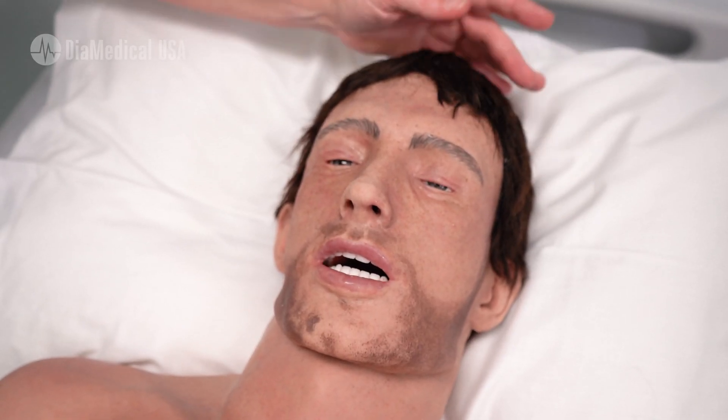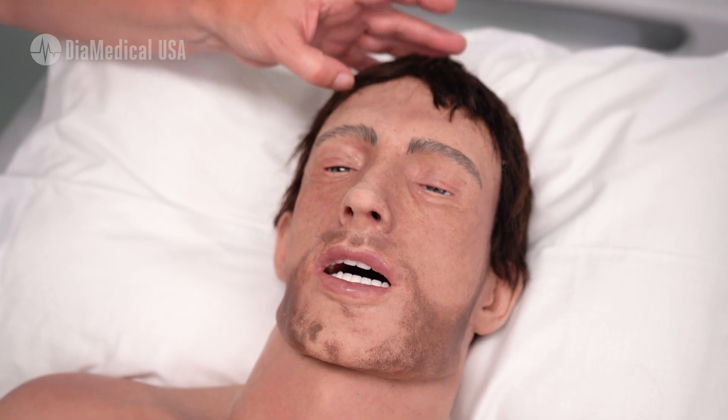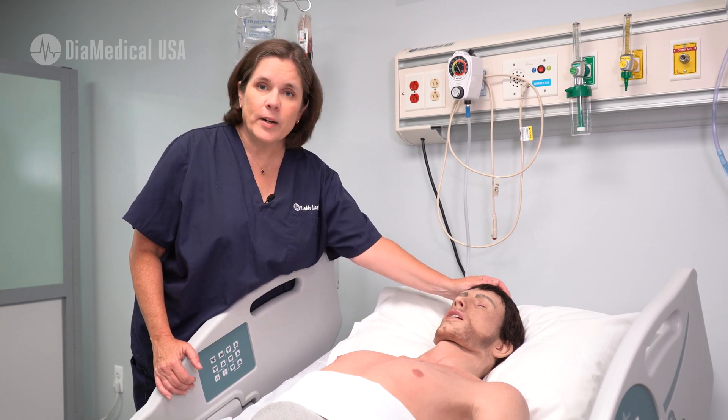Starting at the top, he has real human hair, so it gives students a realistic feel when they're cleaning blood and body fluids and debris from his hair.